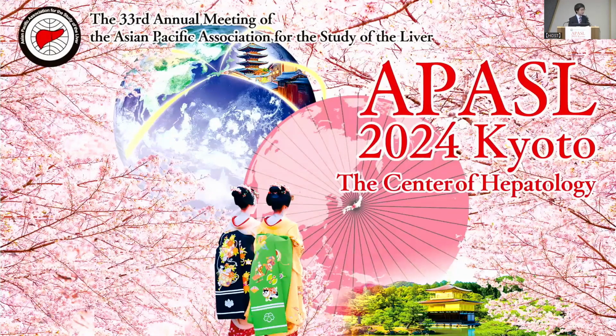Thank you for your great question. So to detect tiny lesions in the liver using an AI model is very challenging because partial volume averaging or motion artifact is prominent, especially on the periphery of the liver. So the tiny sub-centimeter lesion cannot be detected using the sequences.